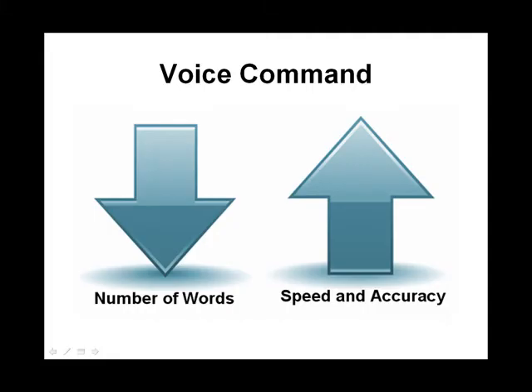Voice command technology is very well suited for periodontal examinations. Although the exams are tedious and data intense, there are relatively few words needed to report the patient's oral health. By limiting the number of words recognized, speed and accuracy increase.